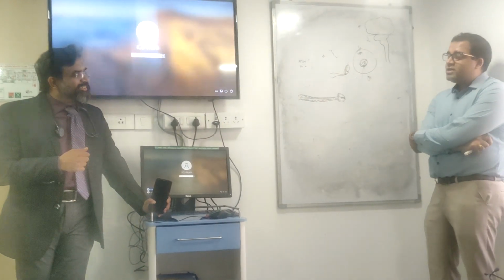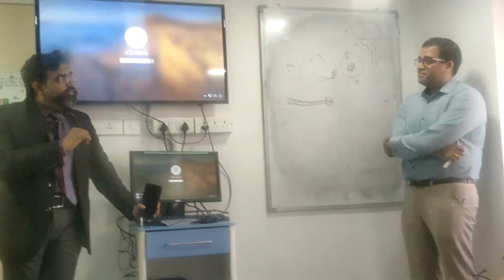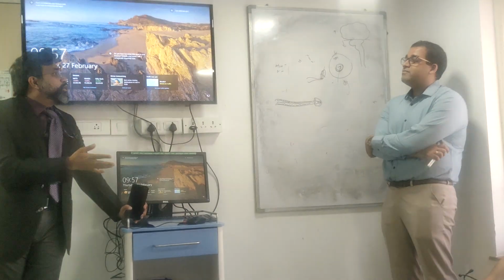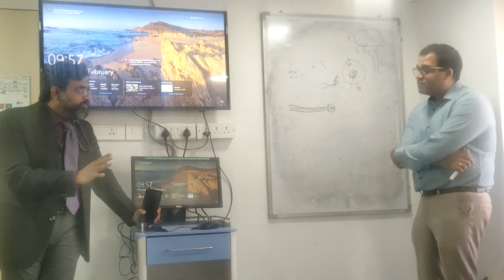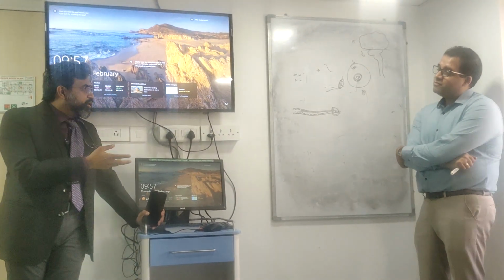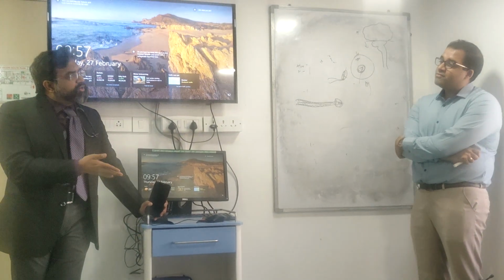Their bottle is different. So why don't we use that bottle, say with 3 ml? Because otherwise, we are sending 40 ml, and by day 4 or day 5 the patient's hemoglobin has dropped by 2 grams. If I were to send a pediatric bottle with 3 ml, I would definitely reduce the amount of blood transfusions.